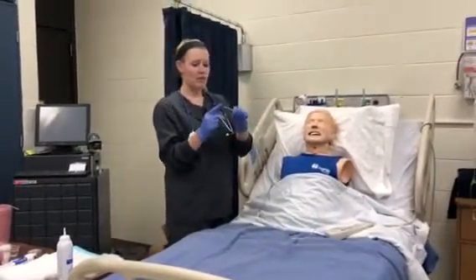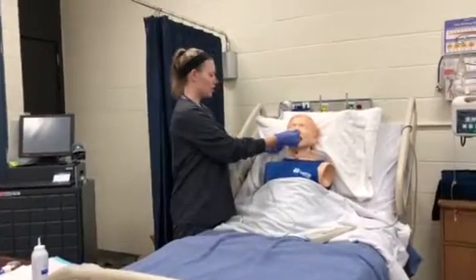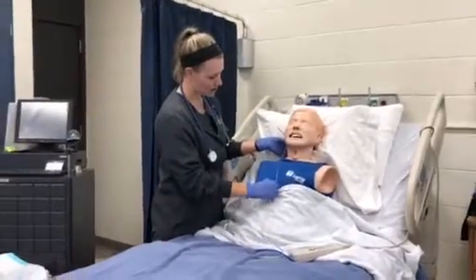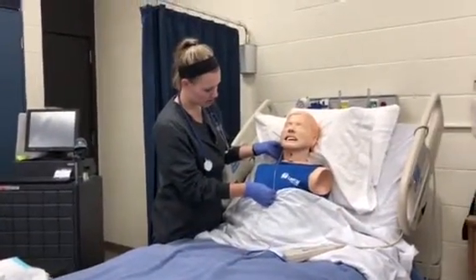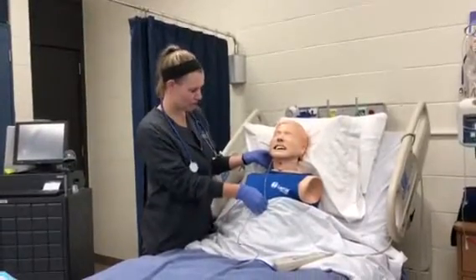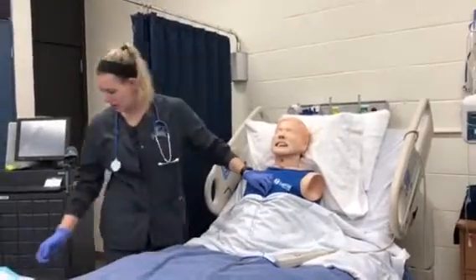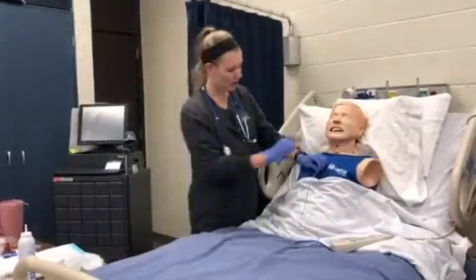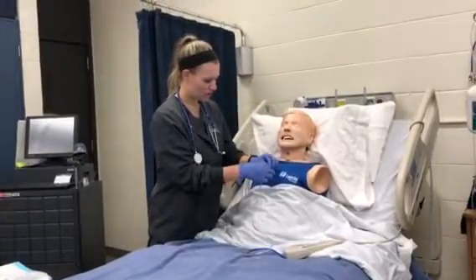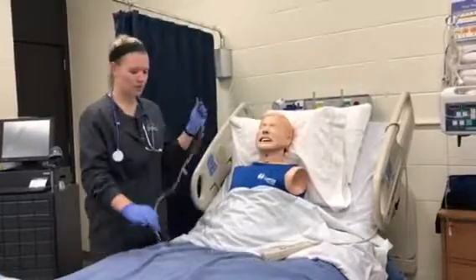So to measure, you start with the tip of this at the tip of the patient's nose. You go to the patient's earlobe, and then down to the xiphoid process. So I'm getting about 52 to be my number. I've prepared tape as well already for this. So I want to mark my 52 spot with tape, so I know that's how far I'm going to go down.